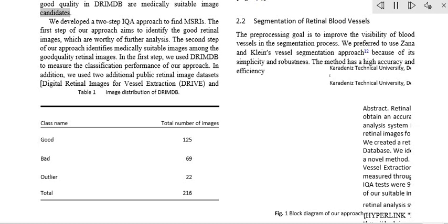Once the candidate region was determined, we extracted the candidate region image from the green channel image and adjusted the grayscale values of the target region, Figs 4a and 4b. We used the Canny edge detection operator to find edges in the target region, Fig 4c. Successively, we used the Hough transform to find circles in the edge image, Fig 4d. The Hough transform is an accumulation method defined as equation 2.